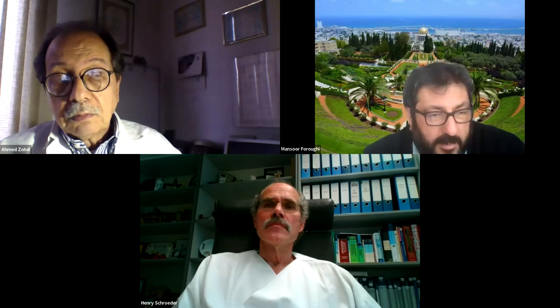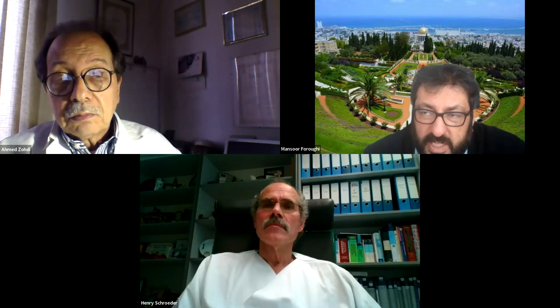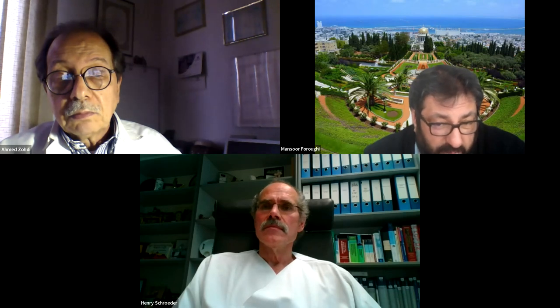Thank you. Perhaps another advantage of the ETV is that you can see the third ventricle. Sometimes you see tiny little seedlings of tumor. It's useful to see that if that is the case. And if you do an ETV, do you tend to leave in an EVD for these cases or a reservoir at all? Or do you just do an ETV in posterior and fourth ventricular tumors?